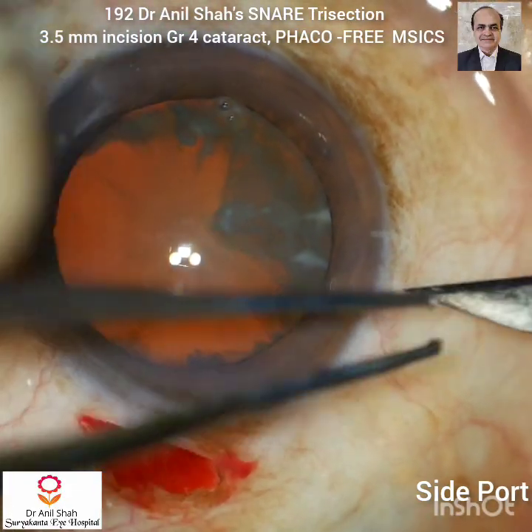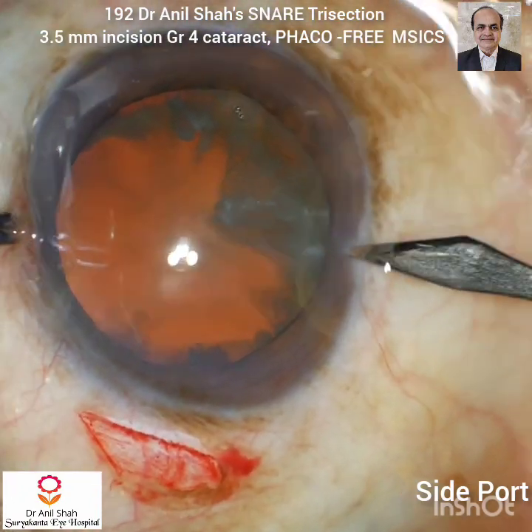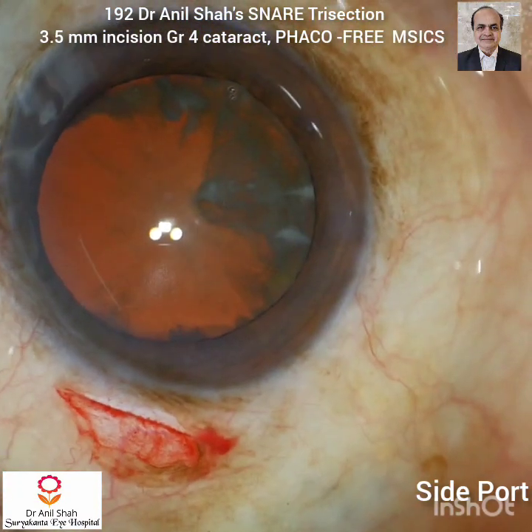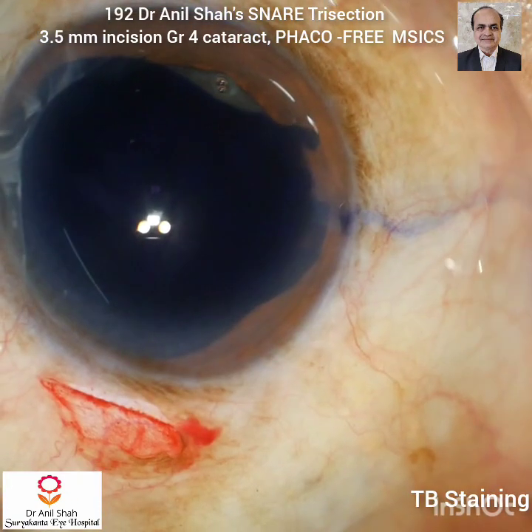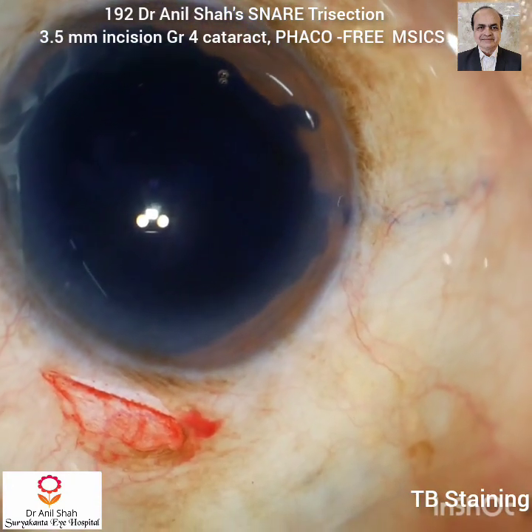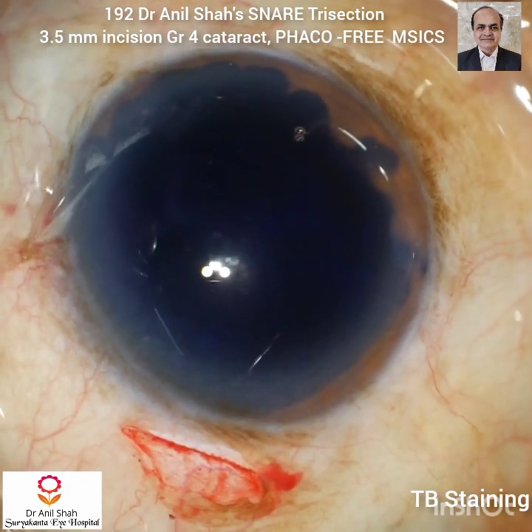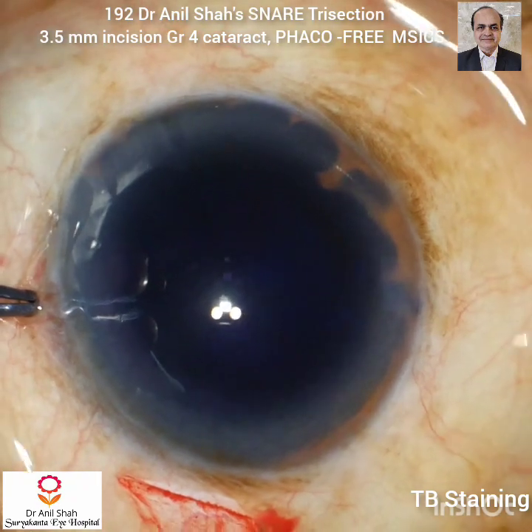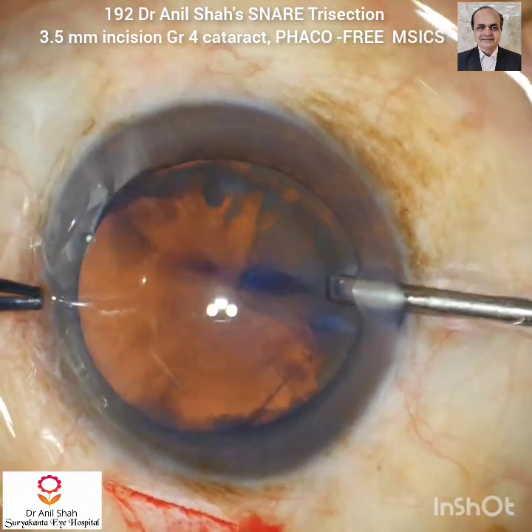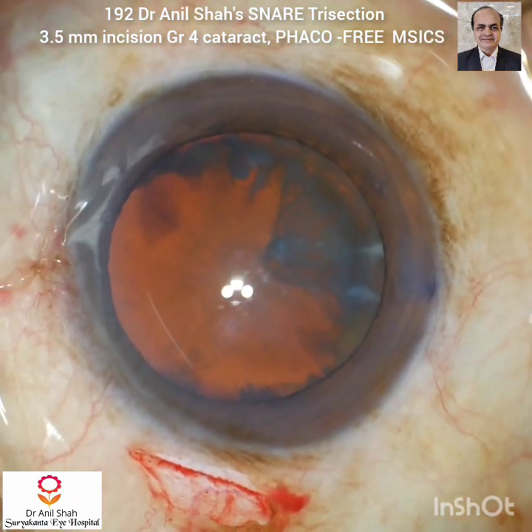Now I am making a side port incision with a side port blade. Now with the Trypan blue I will stain the anterior capsule. Normally I wash the Trypan blue from the anterior chamber with BSS or saline.